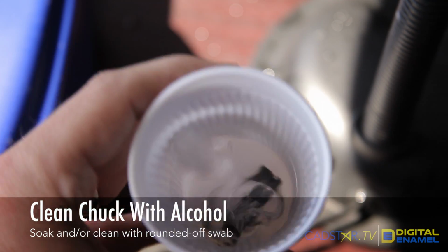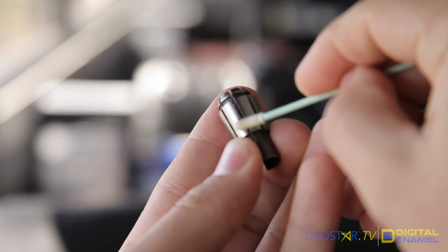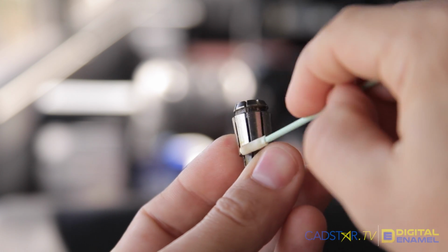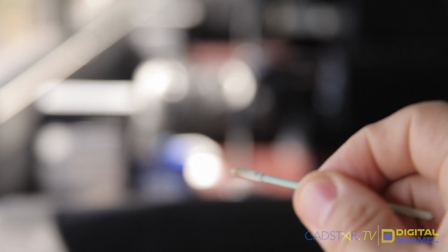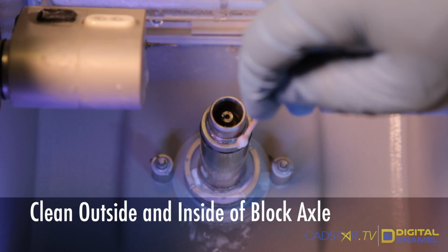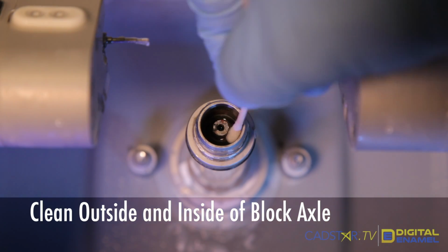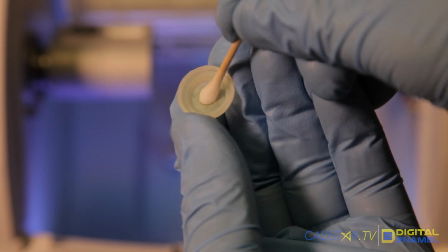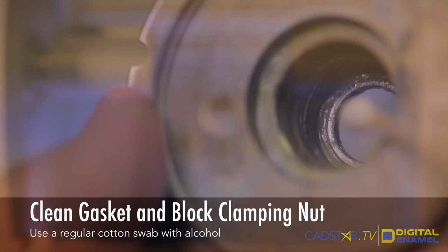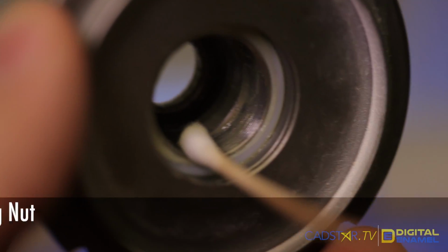We take the chuck, we'll throw it in some alcohol, let it soak, then we'll clean it with the rounded off cotton swab with the alcohol until it's nice and clean. And again, you'll just repeat this until that cotton swab doesn't look dirty. You'll clean the outside of the block axle as well as the inside of the block axle. Then you'll clean the gasket. You just want to make sure that there's no more grease in there. And finally, you'll clean the inside of the block clamp.